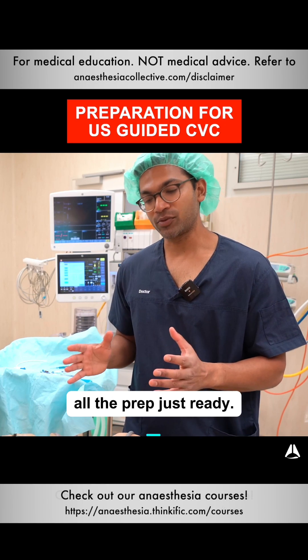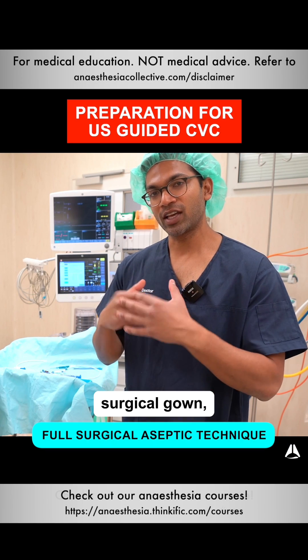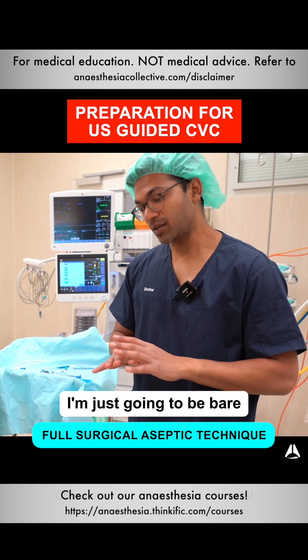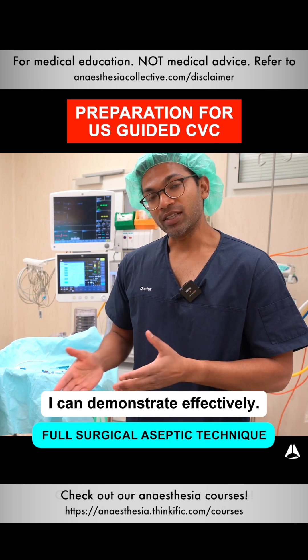Before I get started, I make sure that I've got all the prep ready. It means I've scrubbed, surgical gown, surgical gloves, sterile gloves, mask and hat. But for this demonstration, I'm just going to be bare just to make sure I can demonstrate effectively.